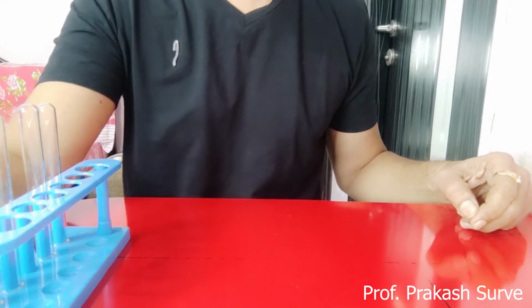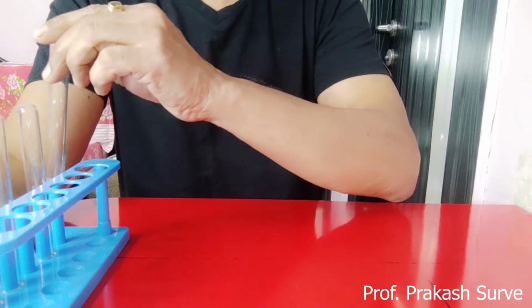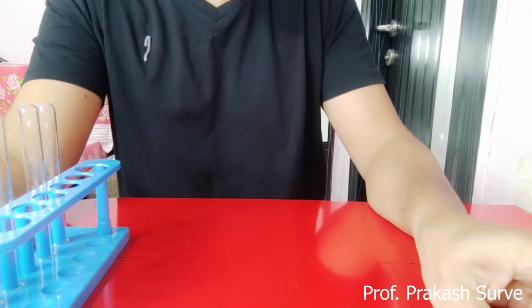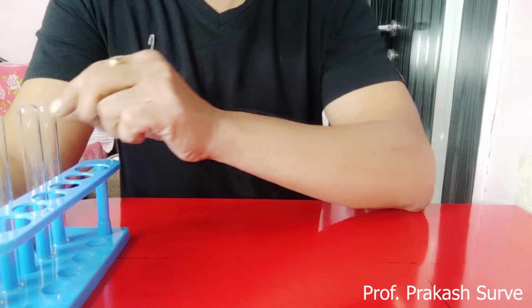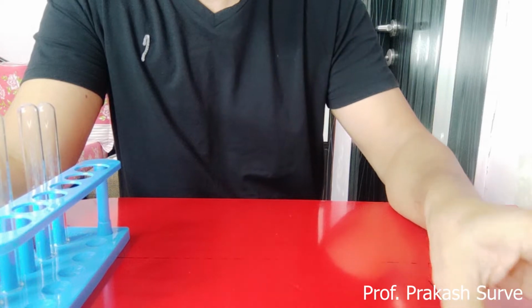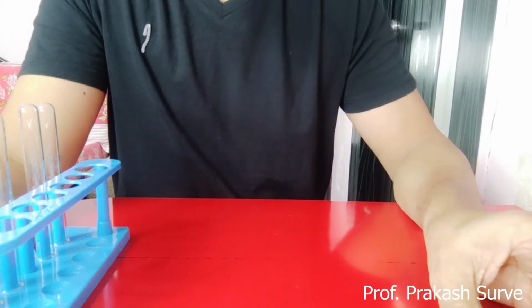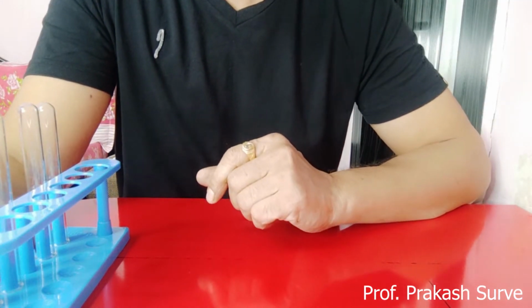Now we'll perform the test for urea, for which the requirements are a test tube and the urine sample. This one is a urine sample, okay. Along with that, we need the soybean flour. Another thing is the phenolphthalein indicator. Again, to repeat, the requirements are a test tube, the urine sample, the soybean flour, and the phenolphthalein indicator. Now we'll follow the procedure. Instead of soybean flour, you can also use gram flour, which is a source of the urease enzyme.